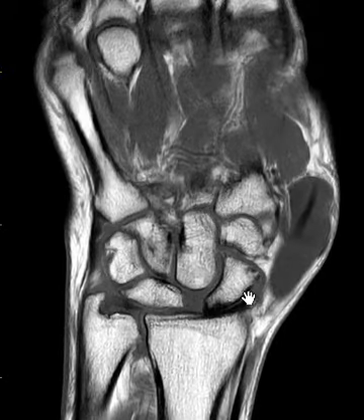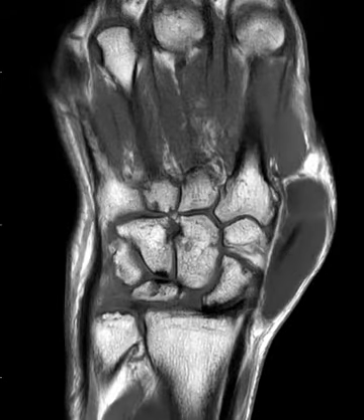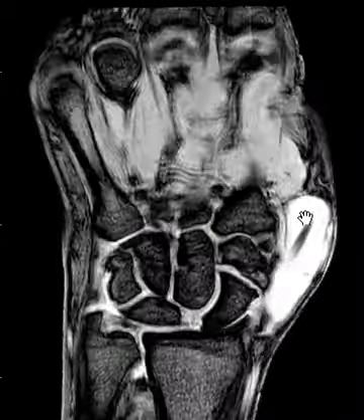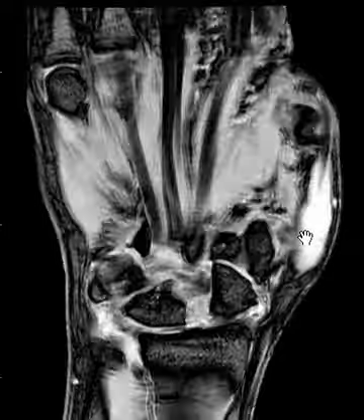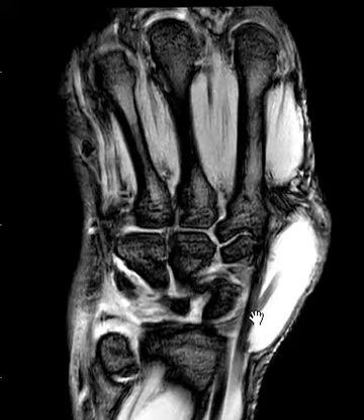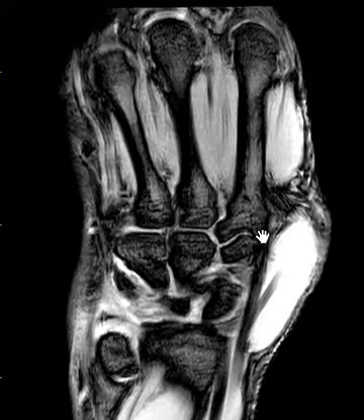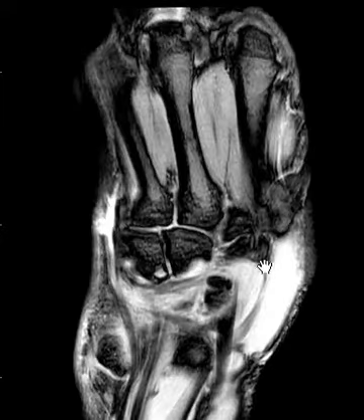There's another finding here. They were worried about a ganglion cyst. We see something over here that is not quite right. If we put up a fluid sequence, we'll see in this gradient echo view that there is a fluid collection, and it looks like there's a tendon that goes through here. This is the extensor pollicis longus tendon. You can see it making its loop around, surrounded by fluid. We see it going across these other two — the extensor carporadialis longus and brevis tendons — and it looks like the fluid is surrounding those as well.